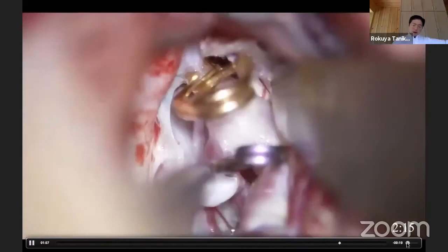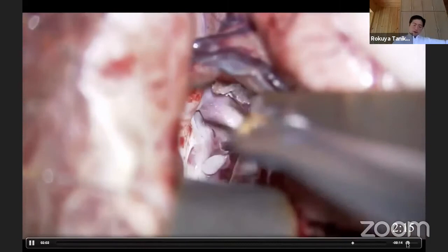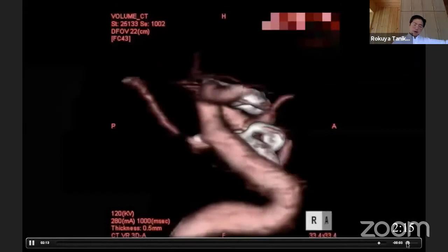I dissect the aneurysm neck and put the clip. With the highest magnification I am adjusting the clip placement, not to bite the anterior choroidal artery arising proximal to the PCOM, medial to the aneurysm. ICG shows good patency of the PCOM and the choroidal arteries and the anterior thalamoperforating arteries.